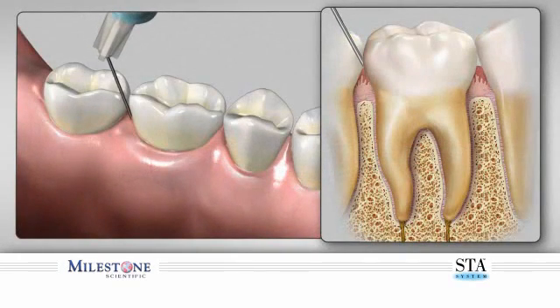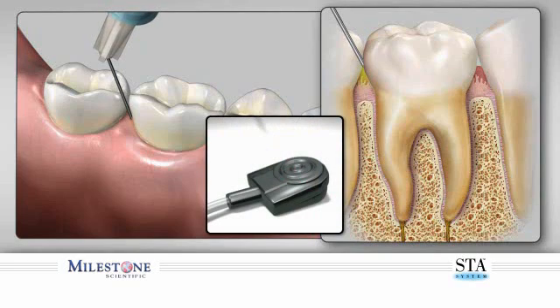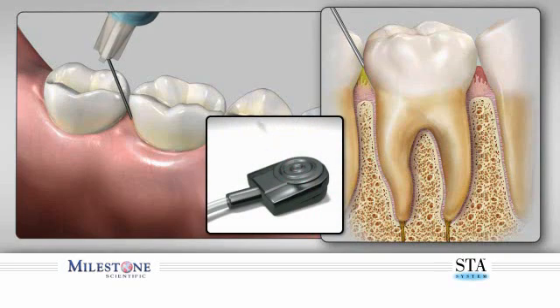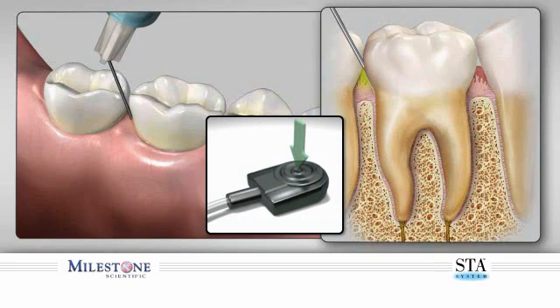While holding the handpiece with a pen-like grasp, approach the tooth at about 45 degrees with the bevel towards the tooth. Place the needle very slowly into the gingival sulcus, as if it were a periodontal probe, while simultaneously initiating the control flow rate.